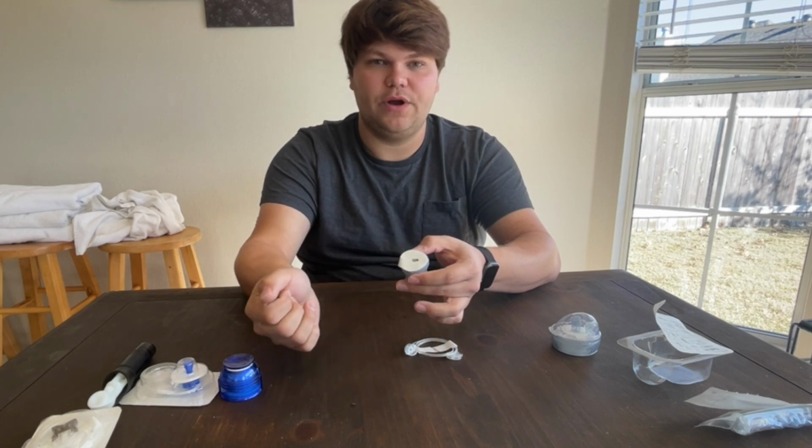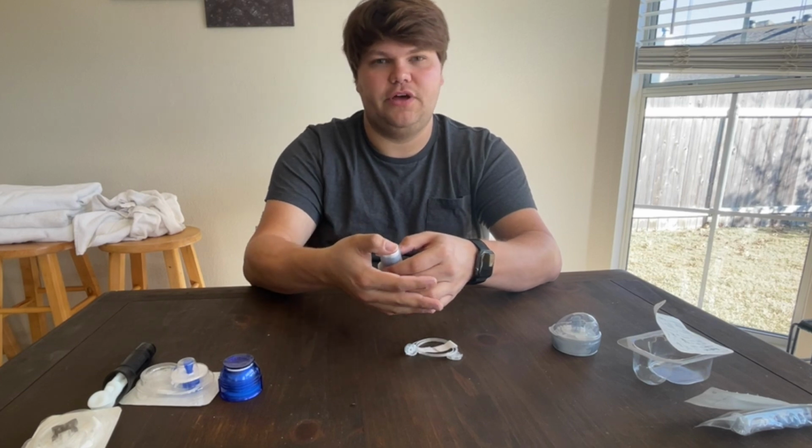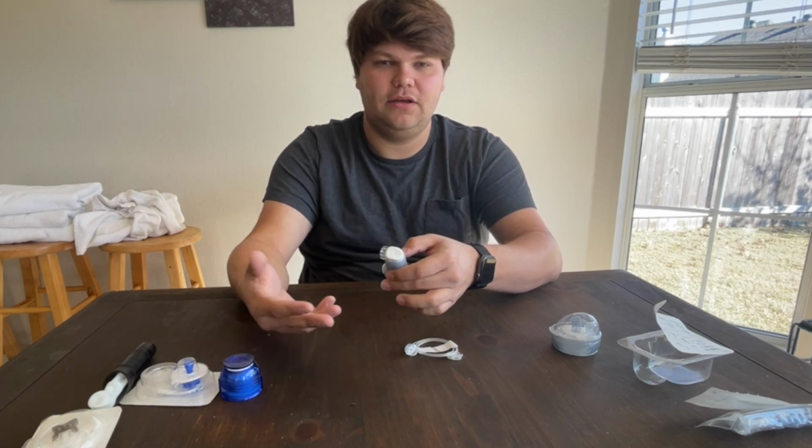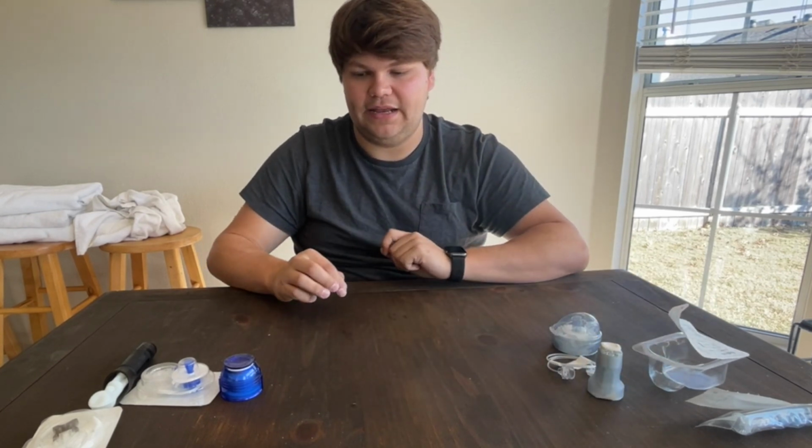place it on the skin where you would want it, and then from that point it's like an EpiPen. You just place your thumb and push, it will click, and it will insert the infusion set into your body, which we'll look at in a second.